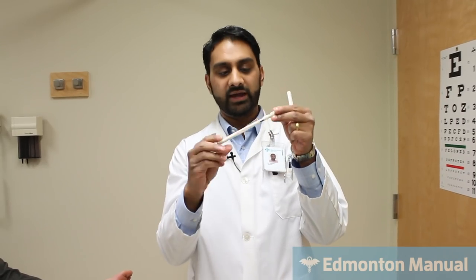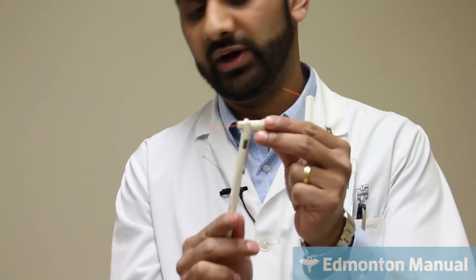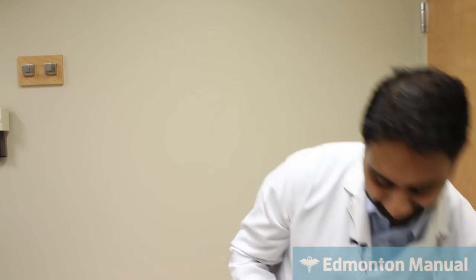And this is a little bit fancier in the sense that it looks like a pen, but what actually it is, the monofilament is hidden there, and so it's protected in that way. And so that can just sit in the lab coat or whatever it might be. Again, there's nothing necessarily better or worse than it. As with all tools, the best tool is the one that you have on you. Okay, so we'll be using this one just for sake of demonstration.